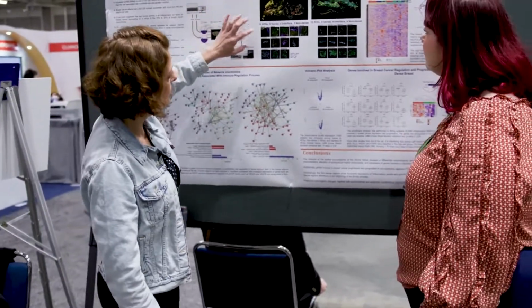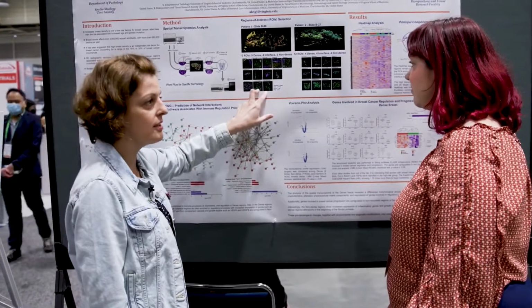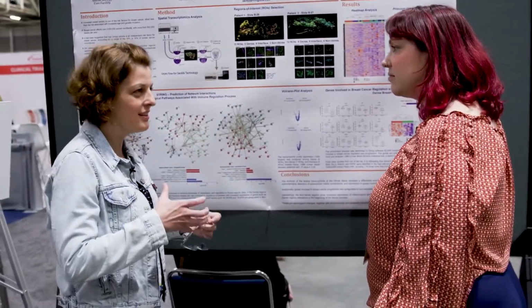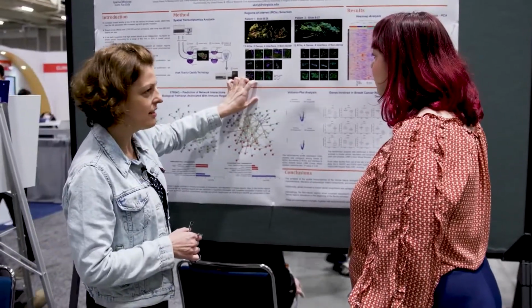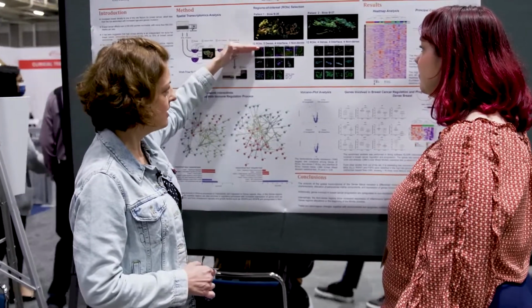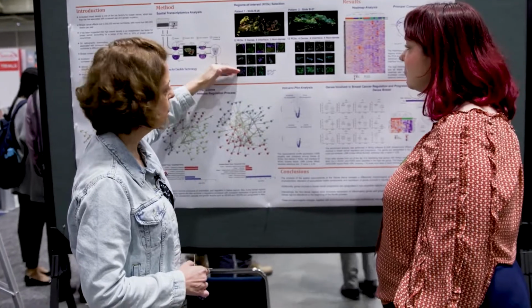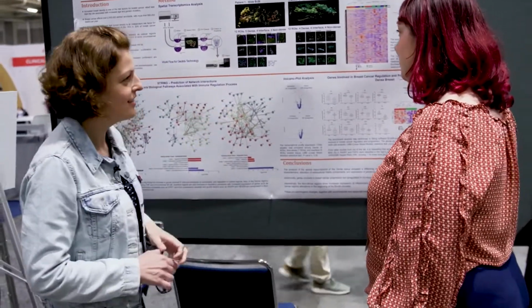If you look here, you can see, for example, here is the fat tissue, which is non-dense breast. And here you see the stroma more dense, without a lot of fat cells. And then you select the dense tissue, non-dense tissue, and the interface between them. I see. To analyze.